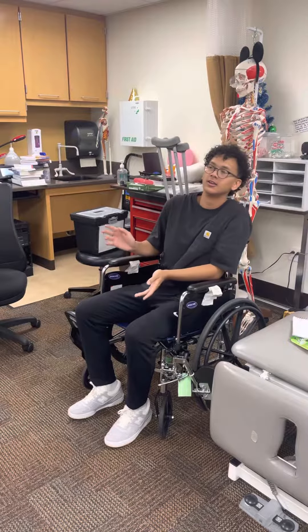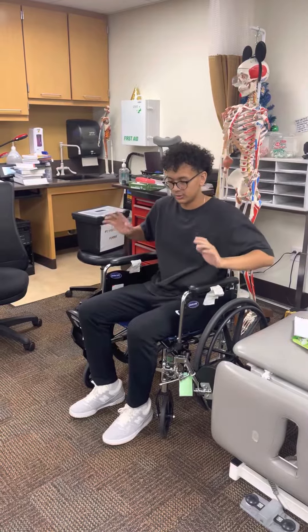We're going to do a four-point pattern with two crutches, which is weight-bearing as tolerated or full weight-bearing. First thing we want to do is use our armrest to scoot forward and then get our crutches.